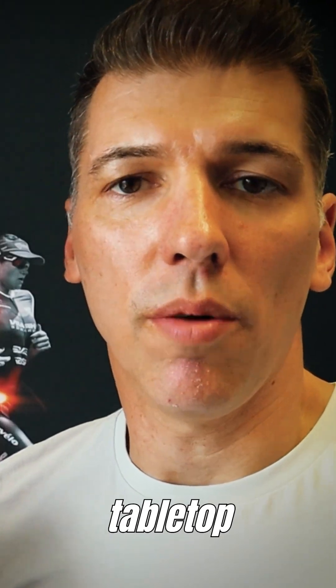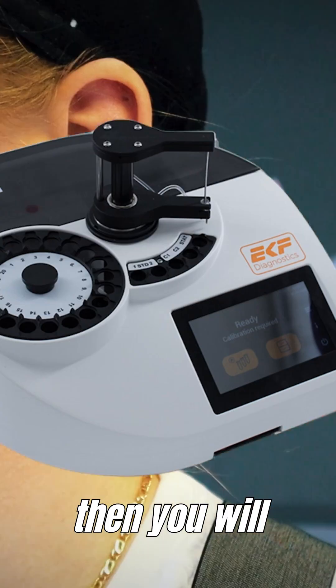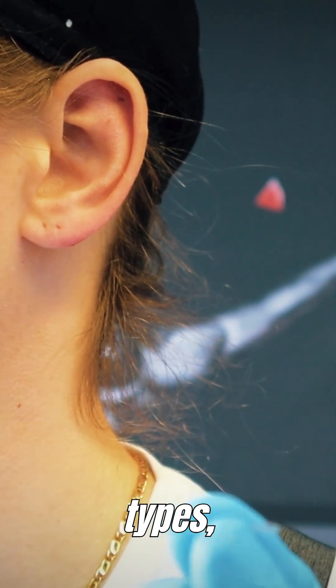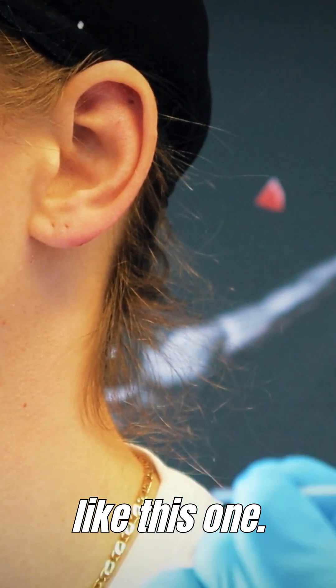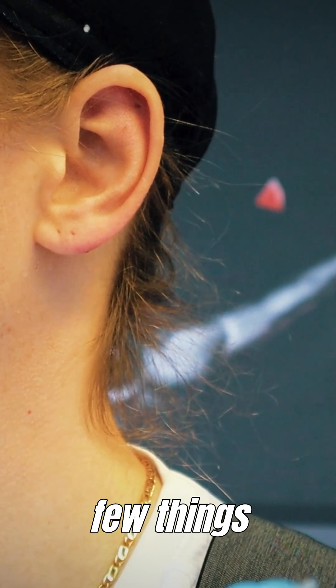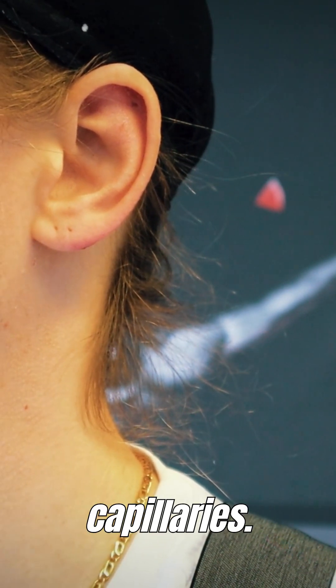In case you're using a tabletop lactate meter like the EKF Biosyn C-line, you will need to use glass capillaries like these ones. There are other types — end-to-ends like this one, there are some that you need to break. There are a few important things you need to take into account when using these glass capillaries.